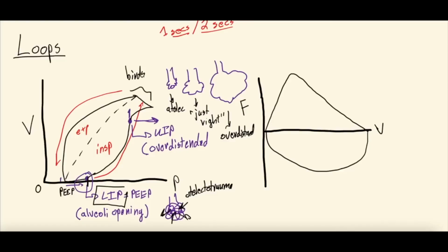It means that your pressures or your volume are set too high, because you're starting to get over distension of the alveoli. So what you want it to look like is similar to how I drew it the first time, if I can replicate that drawing, which is where you don't really have much of an inflection point, and it goes back down into expiration.